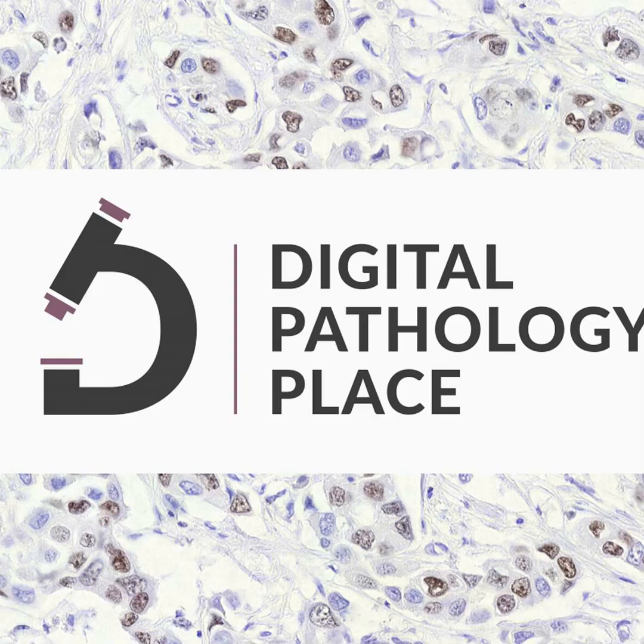So again, high dimensionality is really a big challenge for the human observer, but not only for the human, also for the computer, because these images get extremely large. We usually have images scanned with 12 or 16 bits or even 32. So it's way larger per channel. Then you have multiple channels, and maybe you have a large resection and a whole slide image. So you can end up with 100 gigabytes for one image.